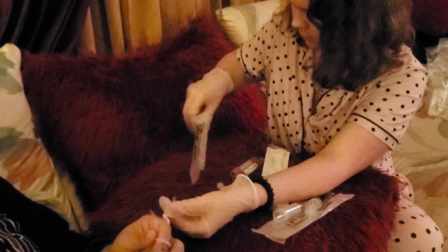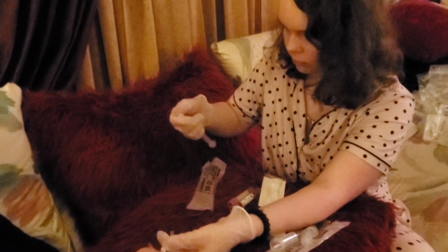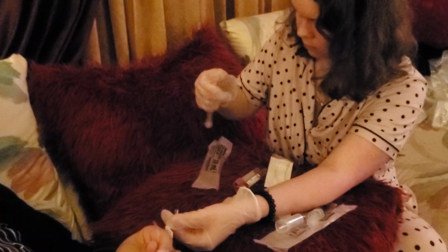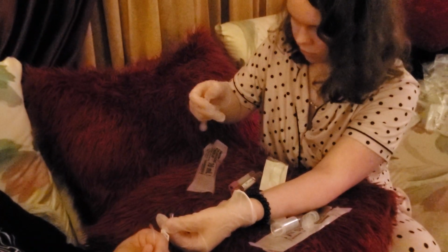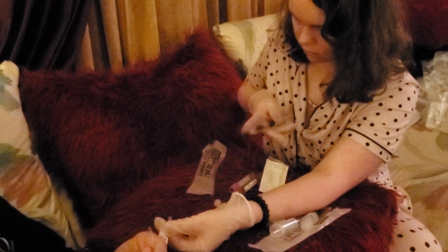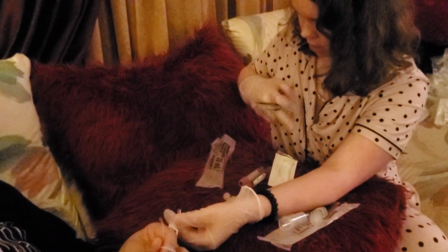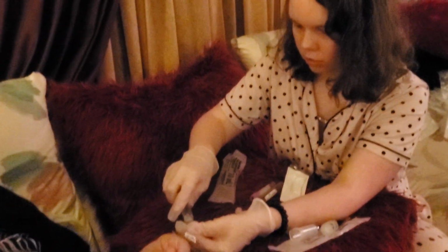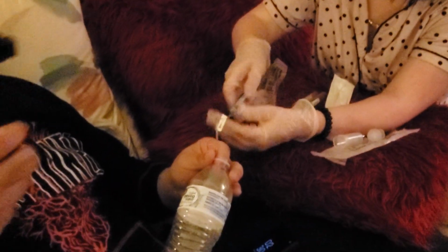I'm going to grab my final flush. Check for air. There's no air. On it goes.